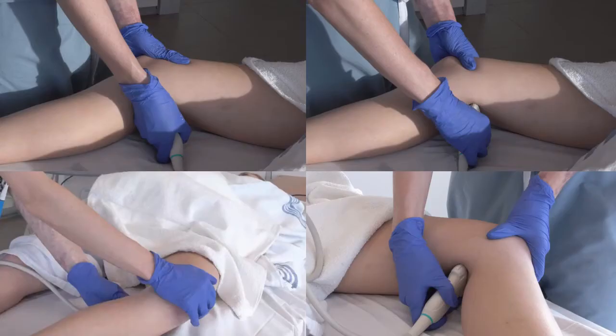Scanning the popliteal vessels can be a little more tricky. For the right leg, you can either keep a pencil grip or use an overhand grip, where you hold the probe like a microphone. For the left leg, you can scan left-handed or use a pencil grip with your right hand facing the patient's feet. In all positions, it's helpful to hold the knee with your non-scanning hand, which stabilizes the knee when you apply pressure. It's important to find a comfortable position that you can sustain for several minutes of scanning.